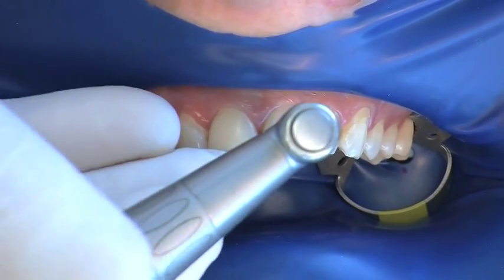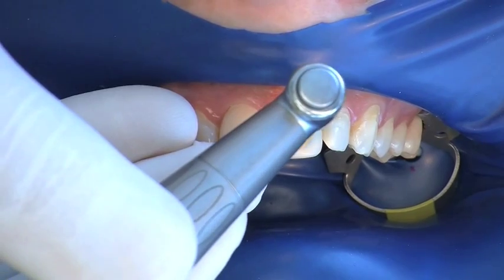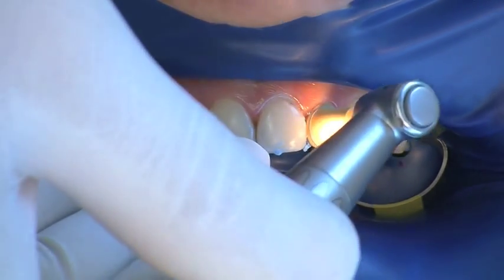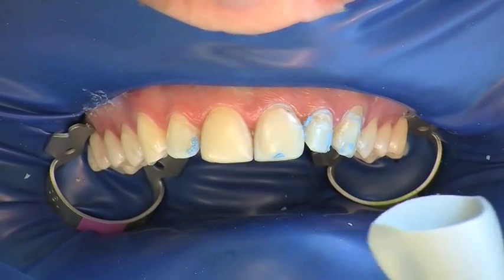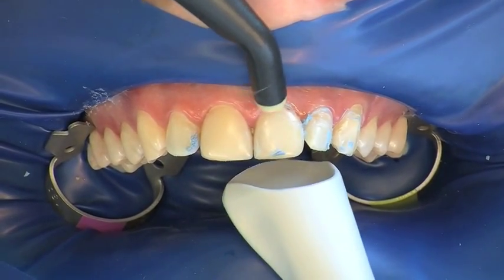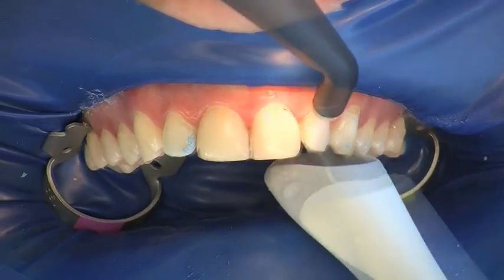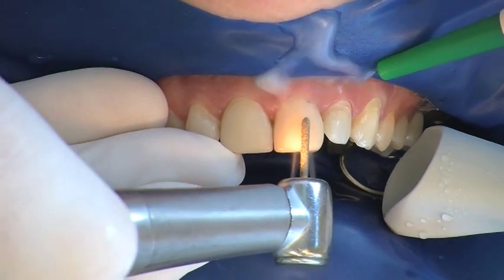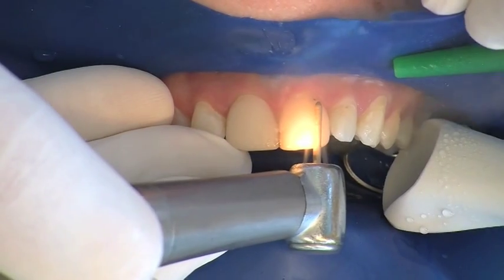The teeth are cleaned with toothpaste and polished with a rubber cap polishing tool to ensure optimum preparation. This is followed, if necessary, by a reduction of the surface of the teeth, removing as little dental hard tissue as possible.